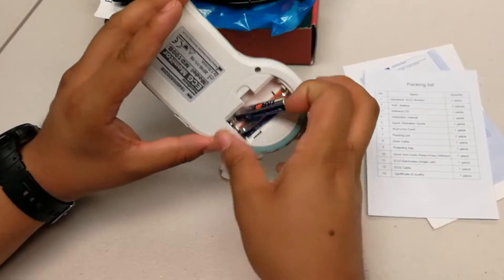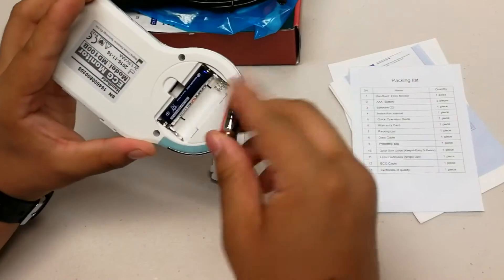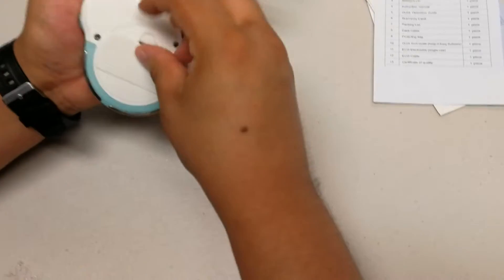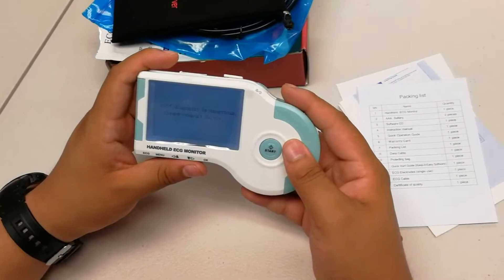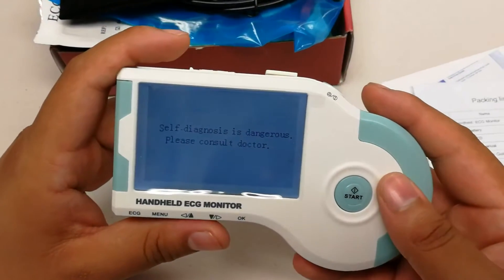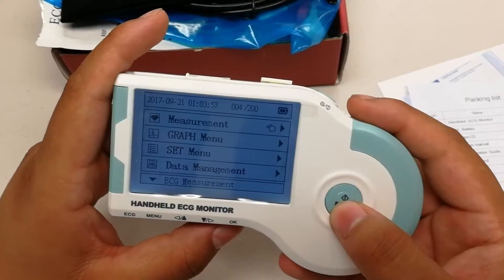Let's put the batteries in. And once the item itself has turned on, you can just press the start button under measurement to begin reading.